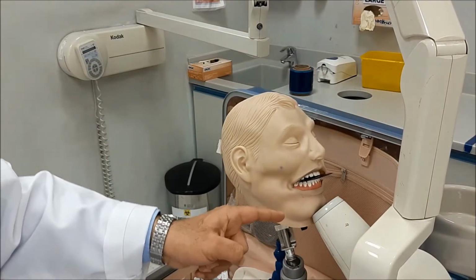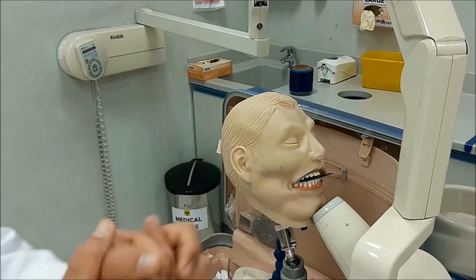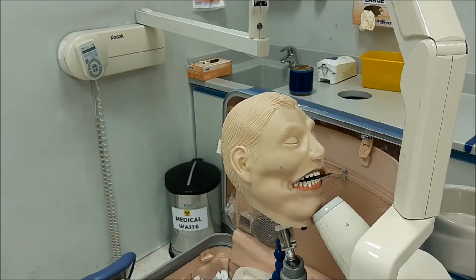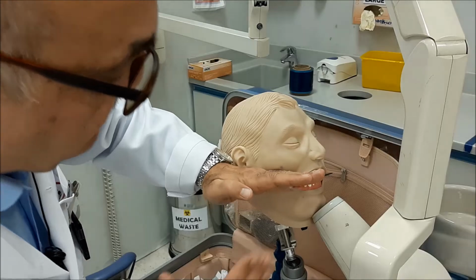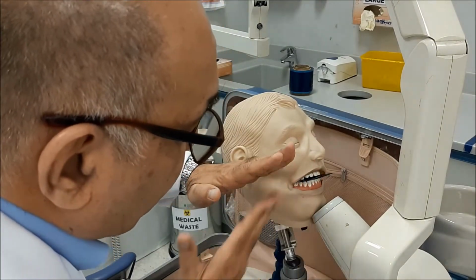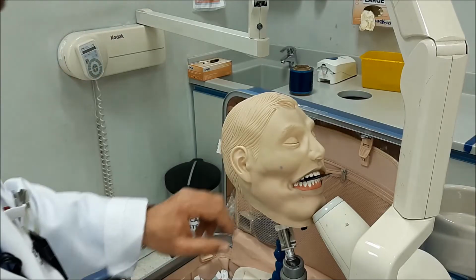You will direct it on the chin of the patient, which is very much similar to the lower incisors periapical exposure, but of course the film position is different. This is the film, and these are the teeth. So you direct it perpendicular on the bisector of the angle between those two. Okay, so this will show the lower anterior or the symphysis area of the mandible.